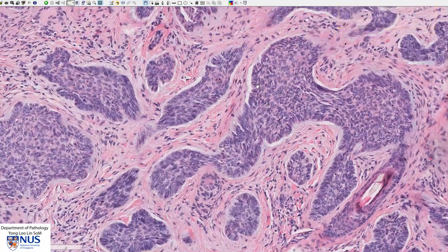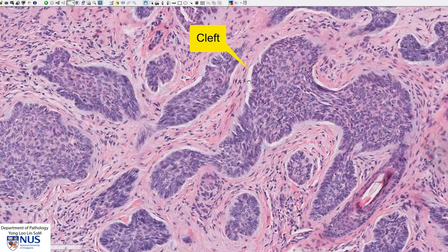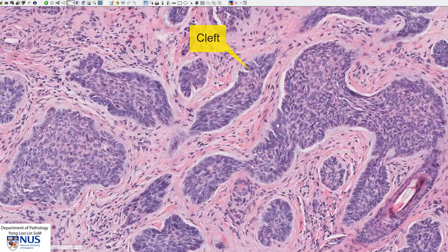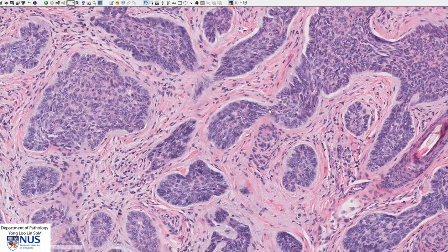Another interesting feature is you can see this clear space or cleft between this basaloid cell island and the surrounding fibrous stroma. This is another feature of basal cell carcinoma. We can also see the clefting here and here.